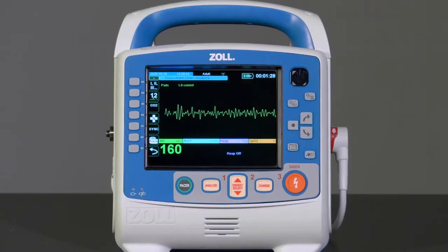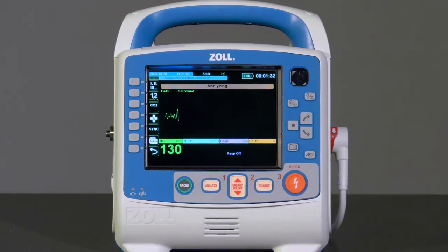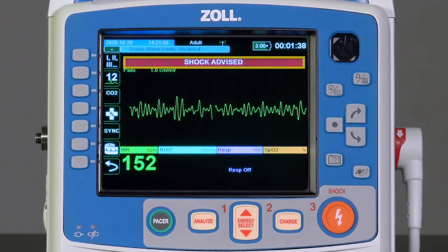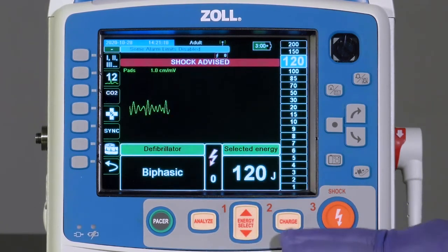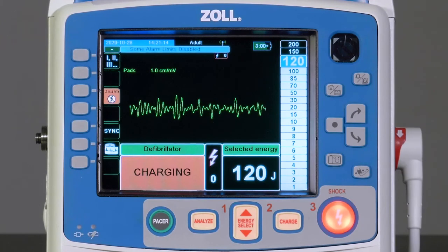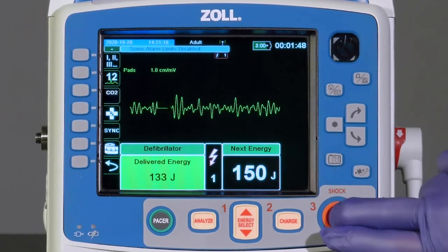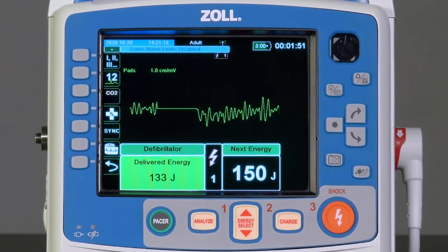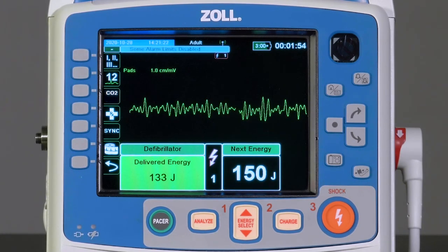When the analysis is concluded, the X-Series Advanced will display either a shock advised or no shock advised message. If a shock is advised, a manual shock should be provided per local clinical protocol. Unlike the analysis CPR protocol function, single analysis will not pre-charge and prompt a shock to be delivered. The device is still in manual mode and the shock must be administered manually.